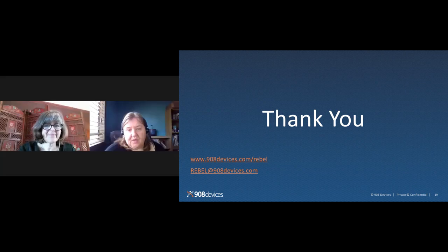Okay, great. So the first question is, are commercially available medium and feed not already optimized for CHO or other cell lines? Great question. Yes, the commercial media that you can find from many different vendors have been optimized. That is correct, but they've been optimized on the cell line that vendor is using. And so to further refine, maybe your cell line has a specific key nutrient that needs to be optimized, or you're looking at a specific quality attribute that needs modulation or specific balancing of some key amino acids.